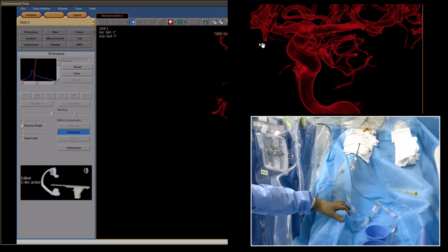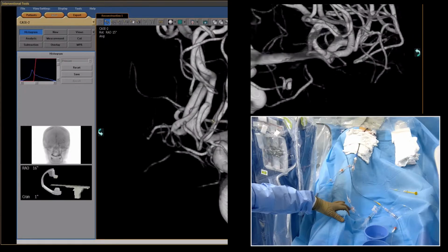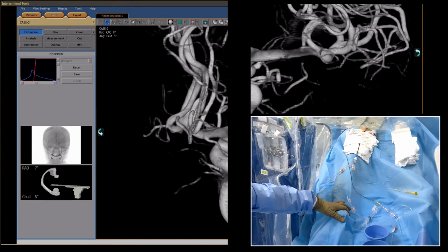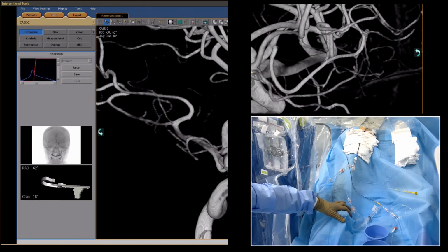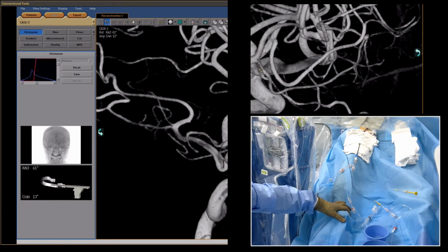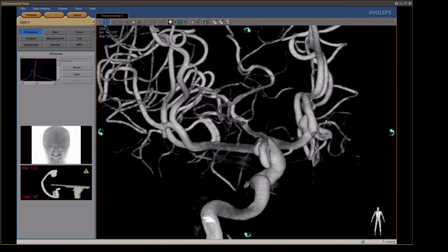Let's look like this. What is coming here? The histogram. Let's look like this, huh? Something like here, huh?